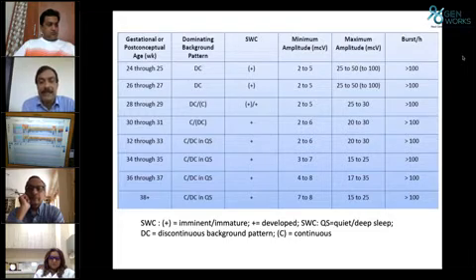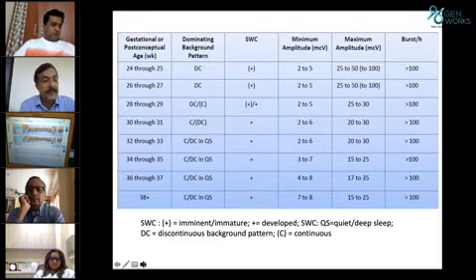If you look into the maximum amplitude, we will show the pattern here. The maximum amplitude is very high in a premature baby, but as we come to maturity, in addition to a continuous pattern, in addition to a sleep-wake pattern at a regular interval, the amplitude comes down. And this is the crux of differentiating a preterm baby's EEG versus the EEG of a term baby.